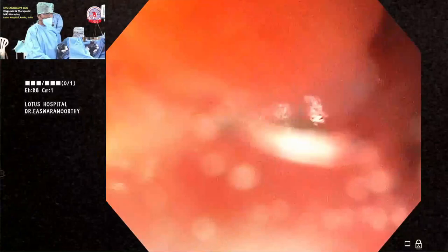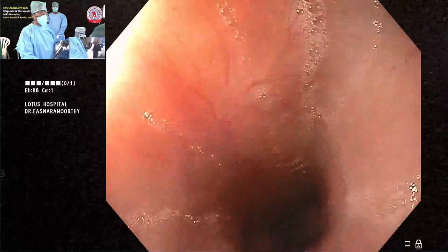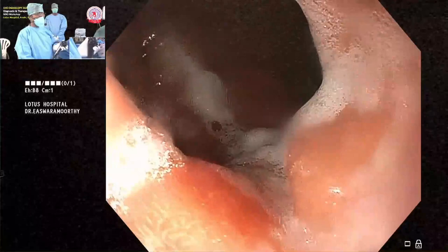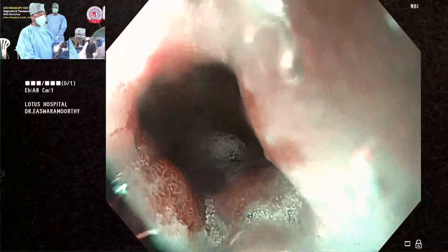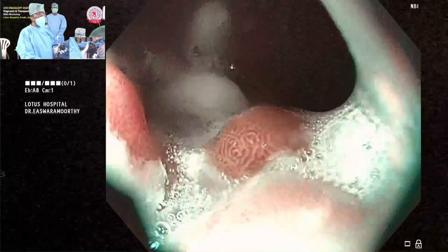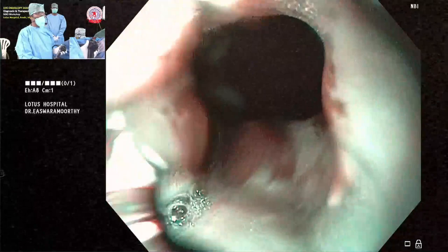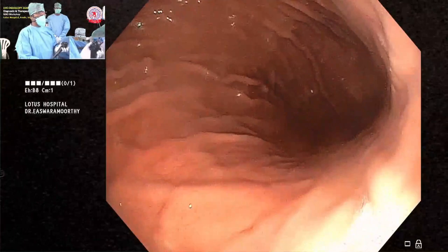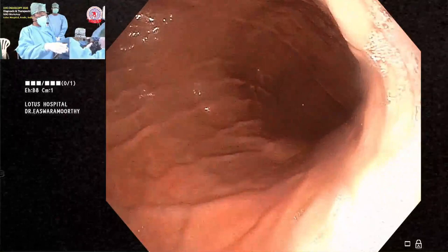This is an anxious patient so I want to spend minimal time at the cricopharyngeal region. As soon as you reach the OG junction, if you have narrowband imaging (NBI) available, use it here. The esophagus in NBI and the transition zone are very well appreciated. Any Barrett's extension at the six o'clock position — the Z-line — can be clearly assessed. This is an additional advantage of high-definition endoscopy. Then switch to white light to continue the examination.